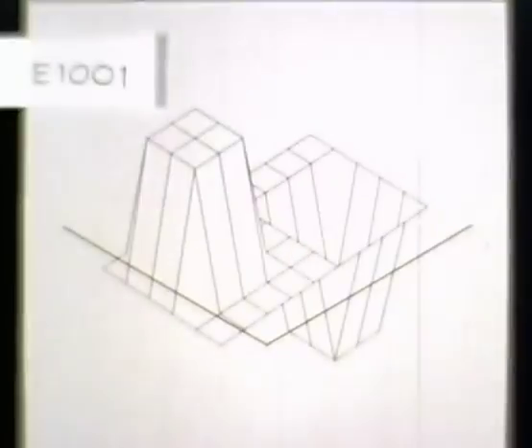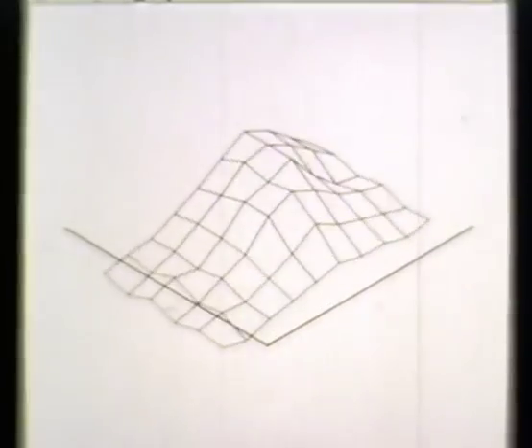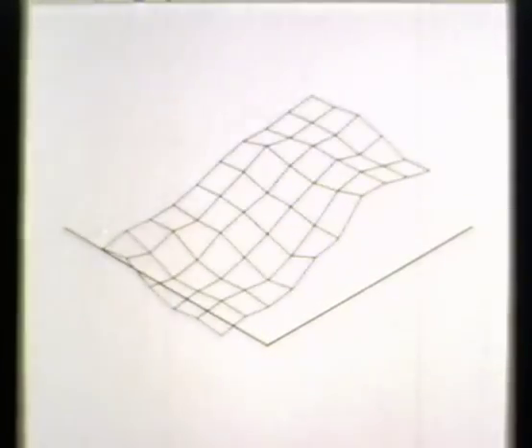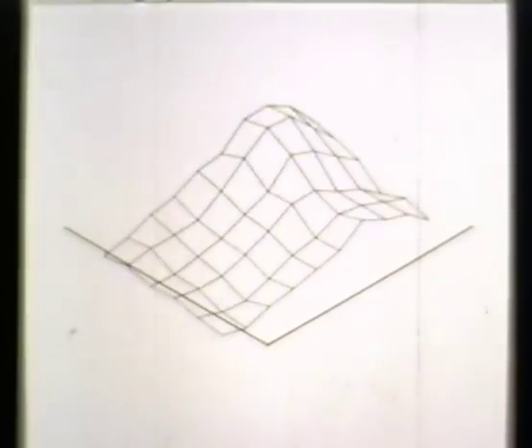They suffice to demonstrate the existence of active or cooperative domains, their locations, the frequencies at which they oscillate, the limits of their spatial extent, their durations in time, and whether they move with respect to the surface. But these surface recordings do not reveal the complex texture which exists within these cooperative foci. The neural signals evoked by sensory stimulation with odors are carried by large numbers of neurons.